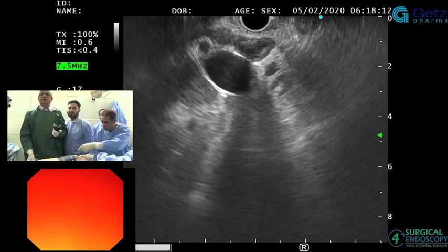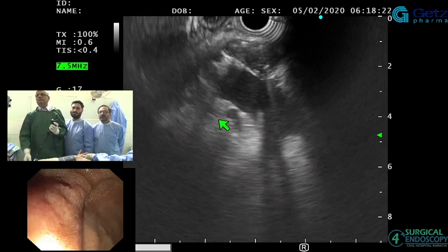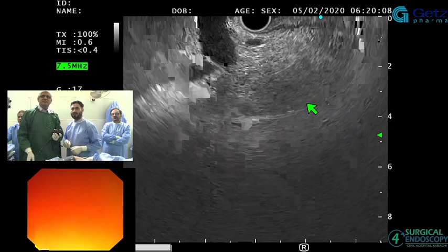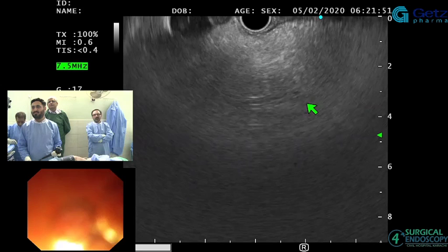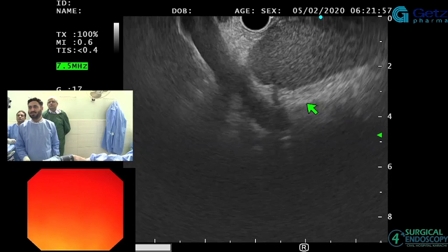So let me bring the cursor. So air out, and we've got cursor. That's the CBD there. That's portal. You can do this as well, and then bring it down a little. ठीक है जी, तो समझ में आया?